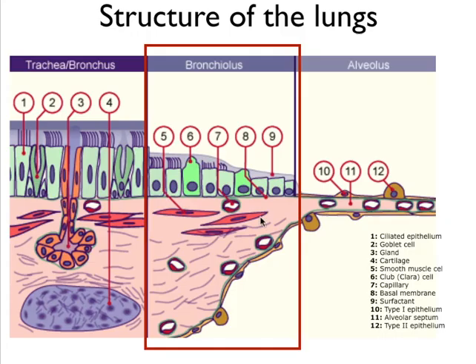So on to the smaller airways, the bronchioles. They're sort of similar, but also a little bit different. There's no cartilage anymore. There are still smooth muscle bundles and vessels, and there still are ciliated cells, but there is a new cell popping up here, and that is called the club cell. And the club cell is also a cell that can produce mucus and compounds that are needed for this lining fluid that is on top of the cells.